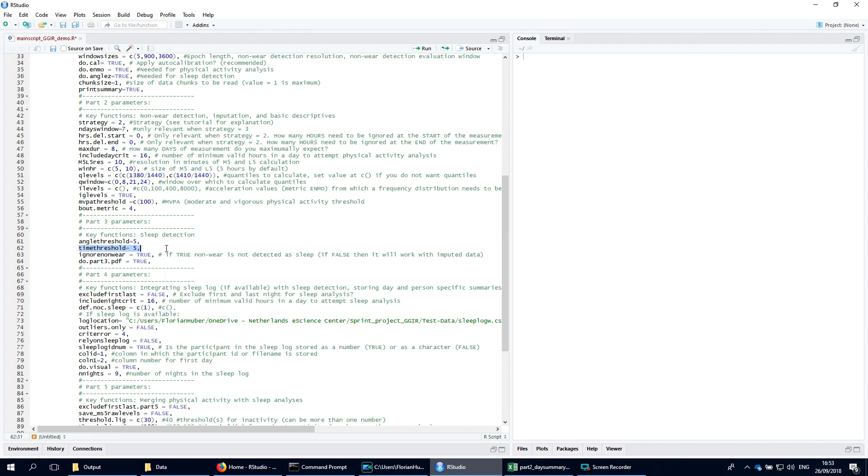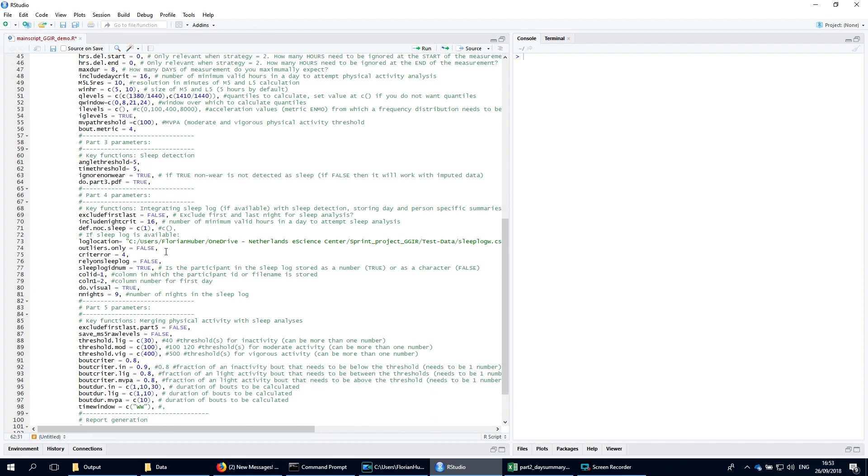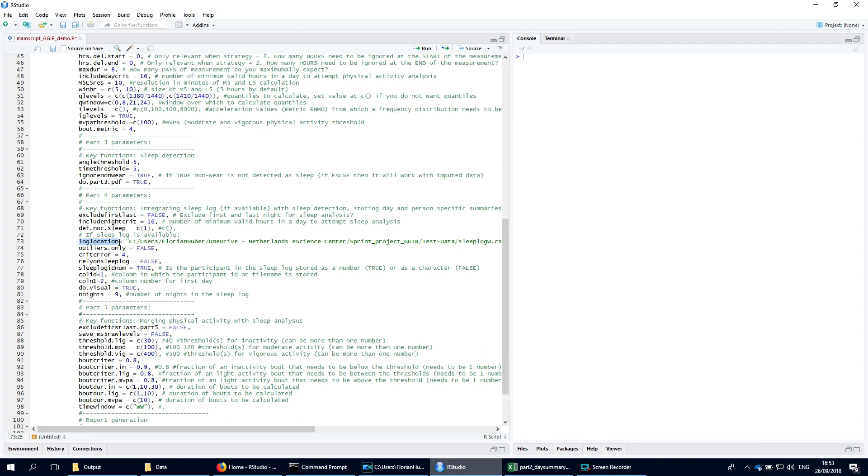Part 4 performs the sleep analysis. Here you can for example specify whether you would like to rely on a sleep log, also known as sleep diary, to guide the acceleration based sleep estimates. If so, then the argument log location needs to be specified with a path to the file in which you have stored the sleep diary.